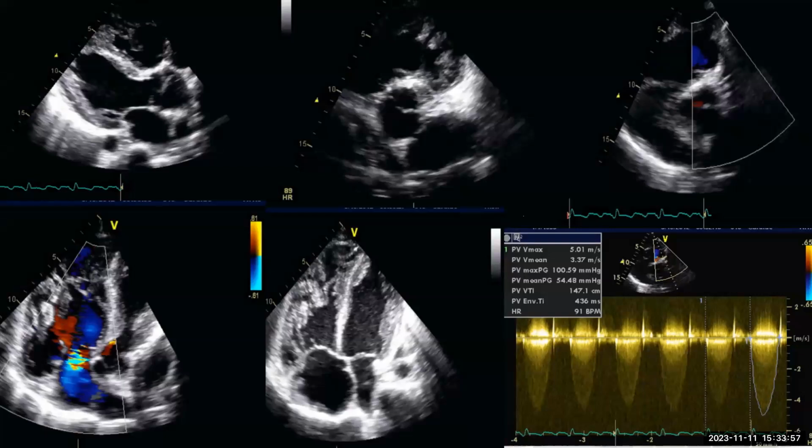One of them is constriction. The other is tamponade. The other is bilateral effusion. Or significant chronic lung disease like COPD. Or if the patient is on a ventilator. So it is totally non-specific. But it is slightly higher in sensitivity. That means if you have this finding with other findings of constriction, you start to think about constriction.